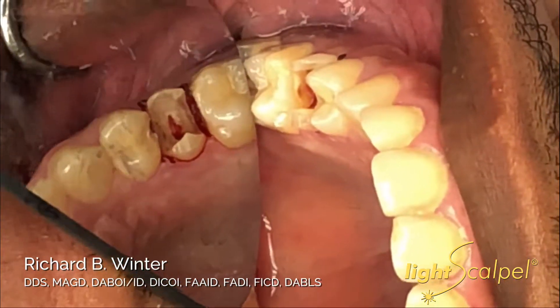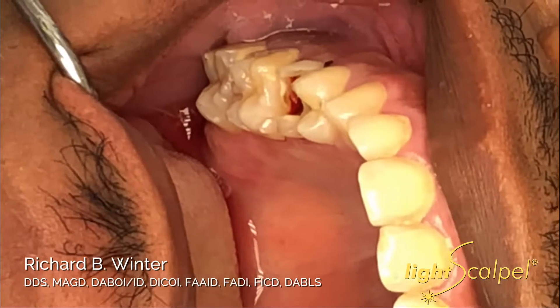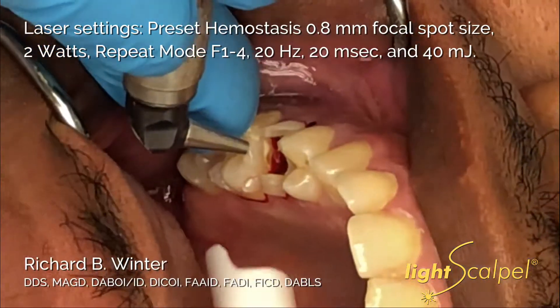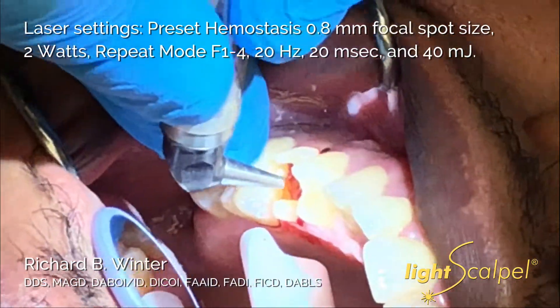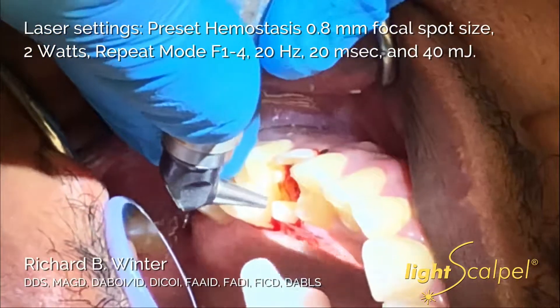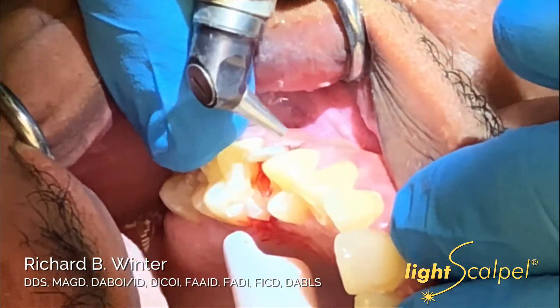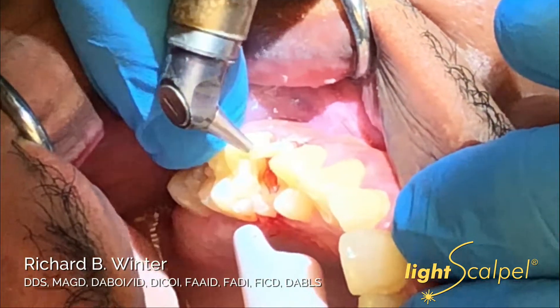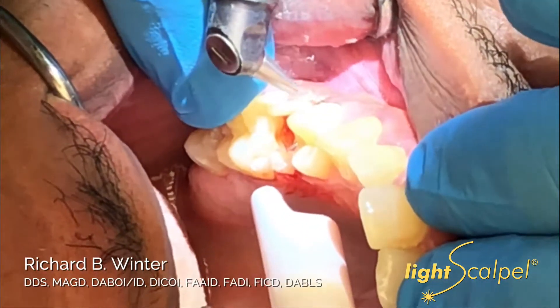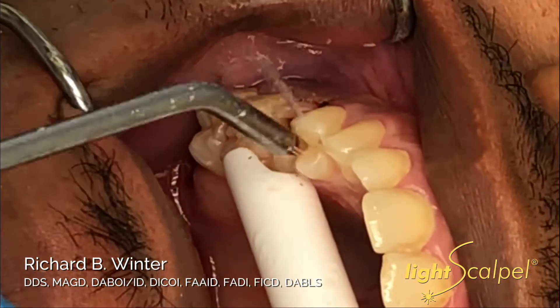You can see we have a nice trough. We've maintained biologic width and have only done what we've needed to do. We can now put the laser on hemostasis mode to create any additional hemostasis we might need. It can gently blend the tissue at the proximal margin. You can actually see here on the facial a little bit of hemostasis that we're creating. And there you have it — we're ready to continue with our root now.